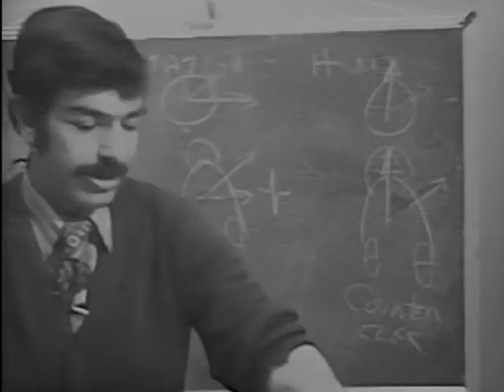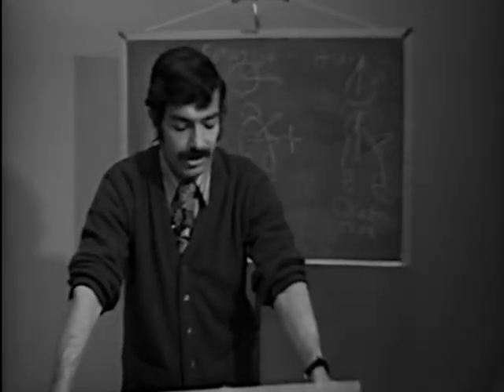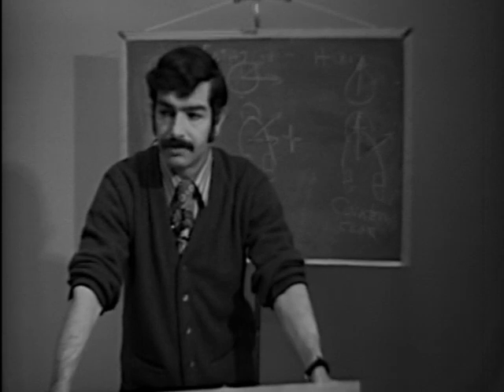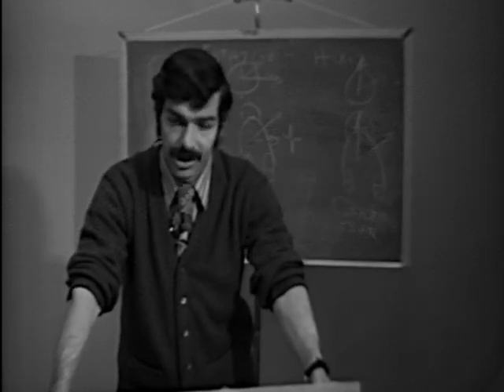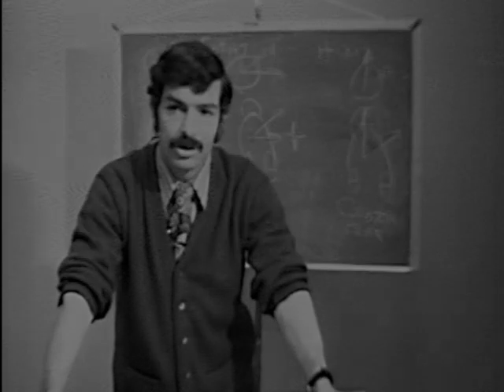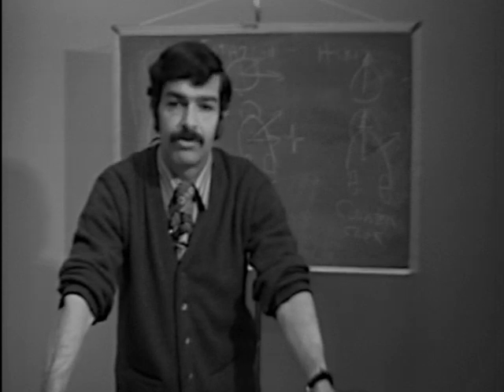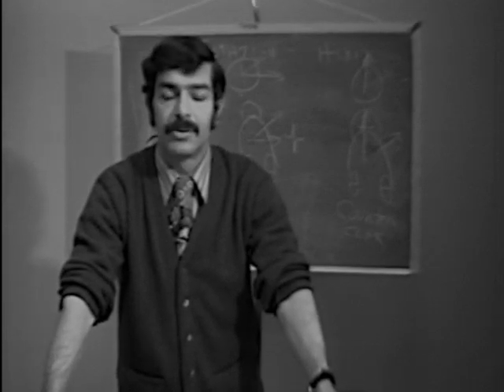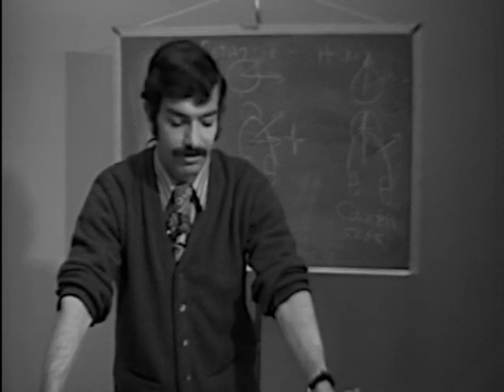Okay, well that covers then some of the fundamentals that we are going to need to know in order to evaluate, in order really to go on. Now, some of these things are more important than other things. So let me just emphasize the things you really have to know in order to be able to interpret electrocardiograms.